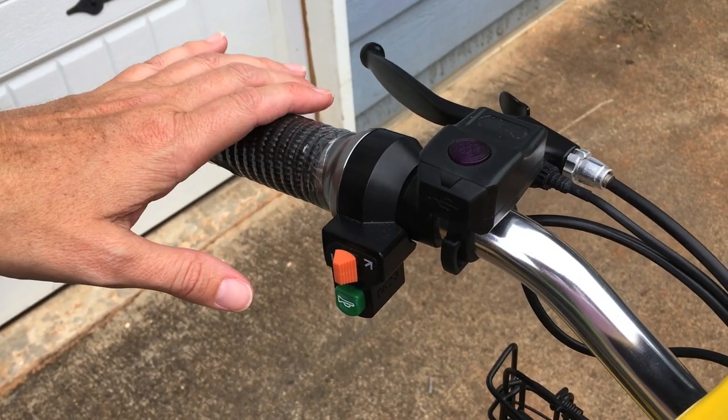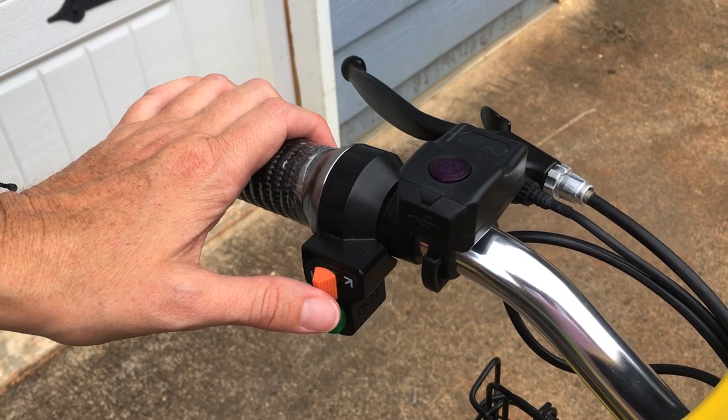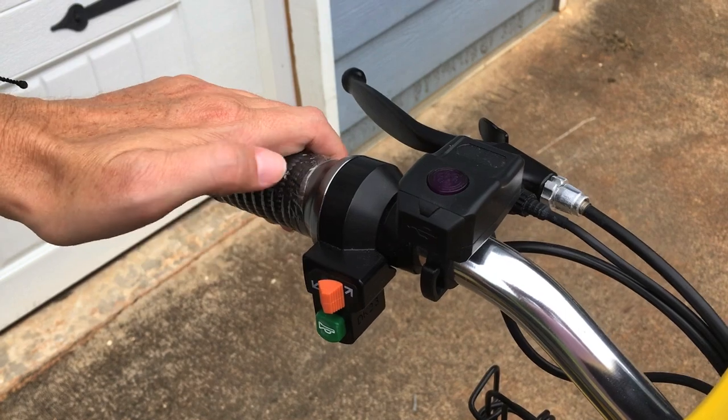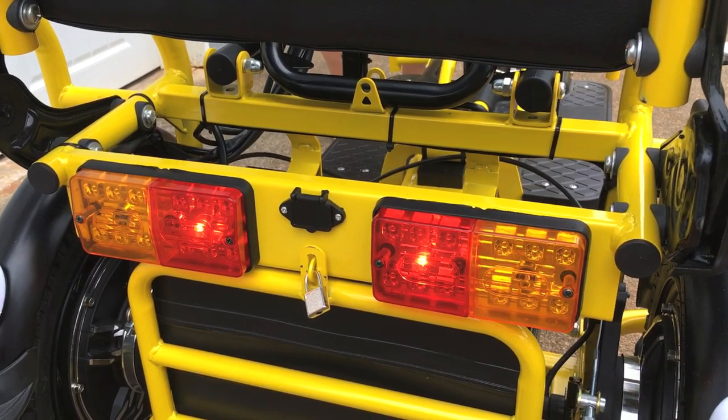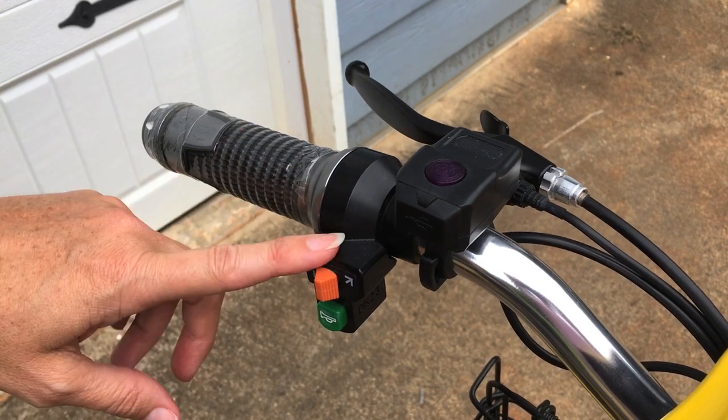On the left hand side you have your turn signals. The Tricaroo is now turned on — here's your left hand turn signal and your right hand turn signal. Make sure to put it back in the middle position so your turn signal is off.